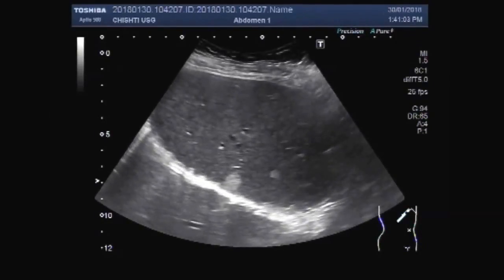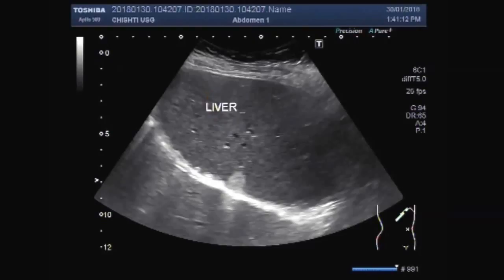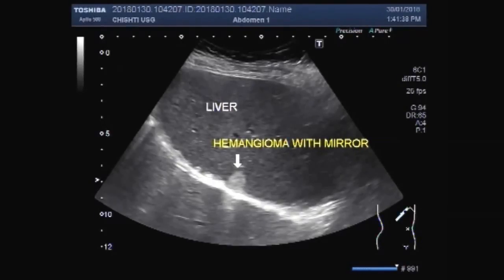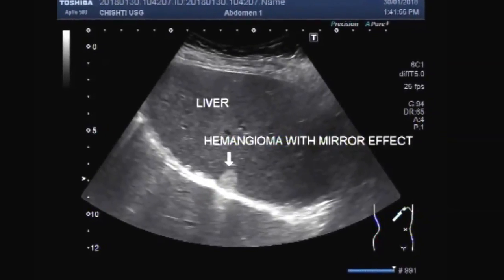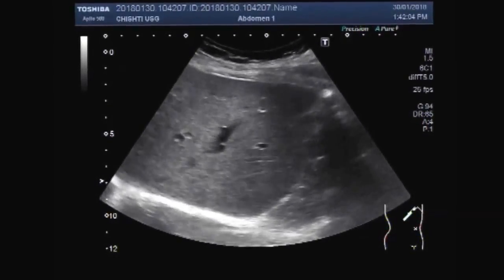The mirror effect is also visible. This is liver and this one is hemangioma. Hemangioma with mirror effect. You can clearly differentiate between the hepatic mass and hemangioma.